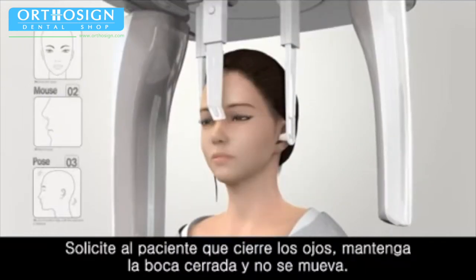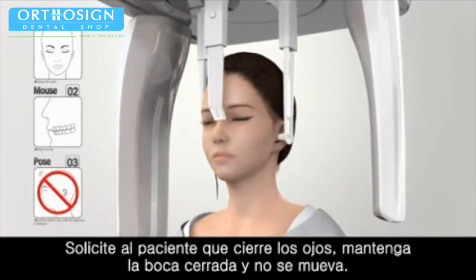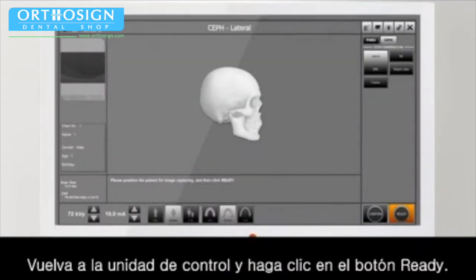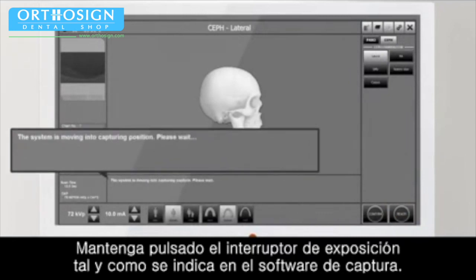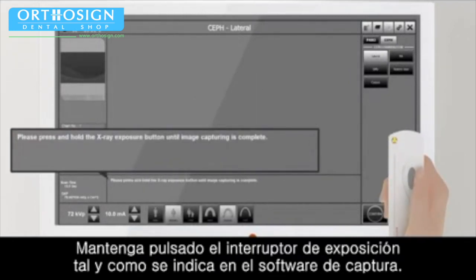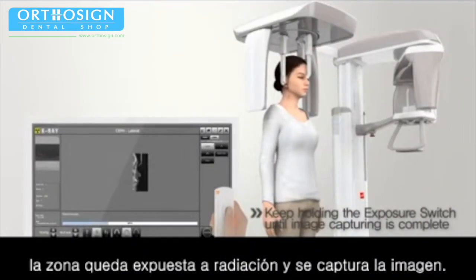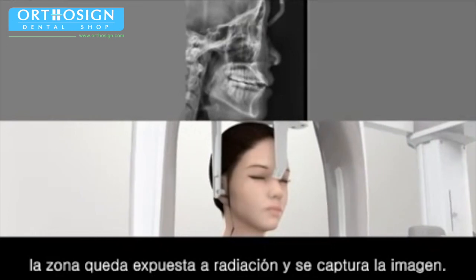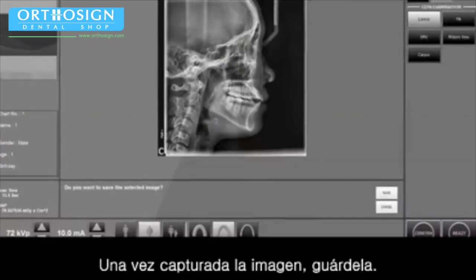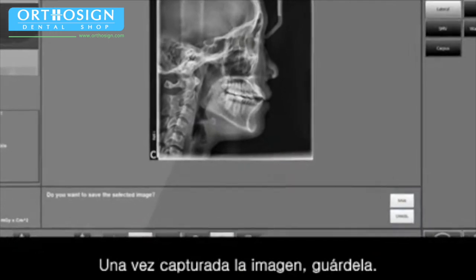Ask the patient to close eyes, keep mouth closed and not to move. Back to the control unit and click the ready button. Press and hold the exposure switch as guided in the capture software. While the exposure switch is held, radiation is exposed and proceeds taking the images. After the image acquisition, save the captured image.